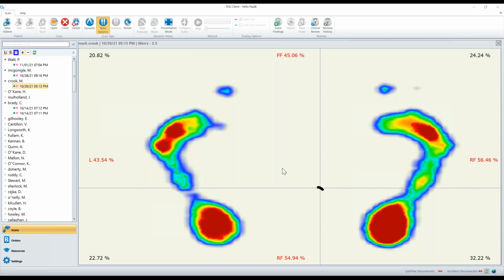And this may be something that you're doing anyway, but when you show a patient this, it's the same as before, as we've discussed before. A picture paints 1,000 words, and patients, when they see this, they know straight away, they get it. They understand that, okay, I should have more toes than this hitting the ground. And they understand that a weight distribution of 15% overloaded onto the right side is not going to be good long-term for their right hip or for their right knee, especially if they're into sport or they want to get into sport.